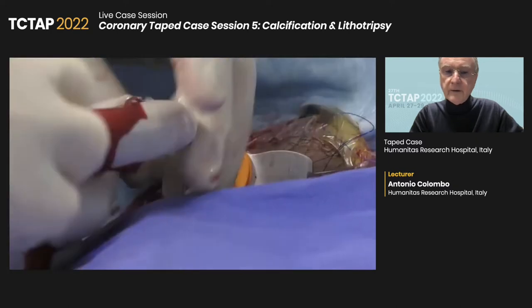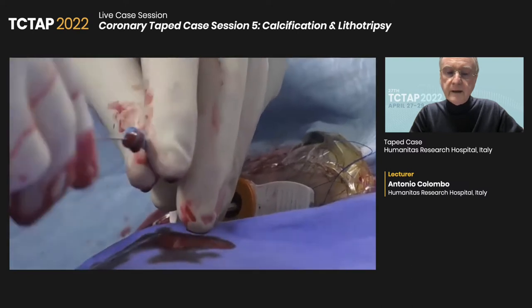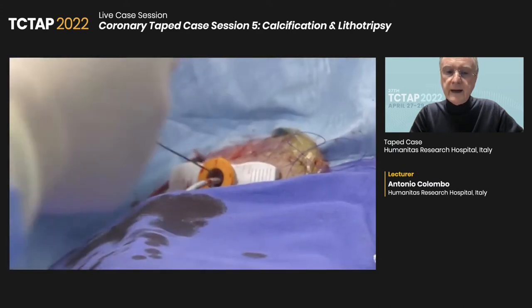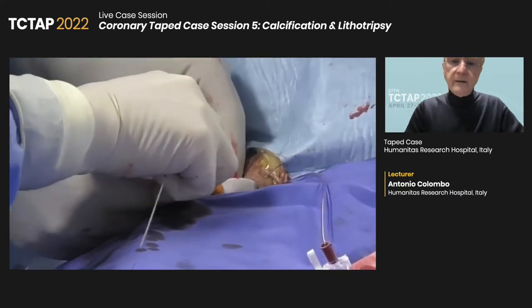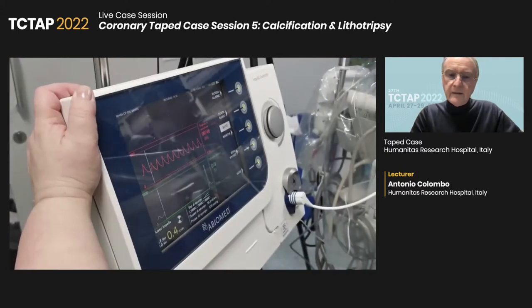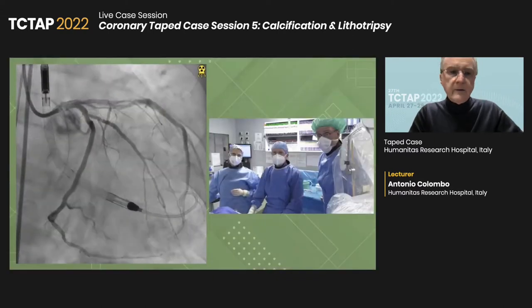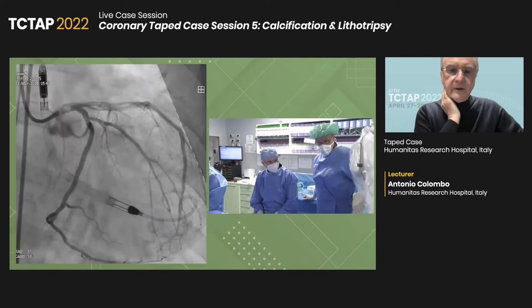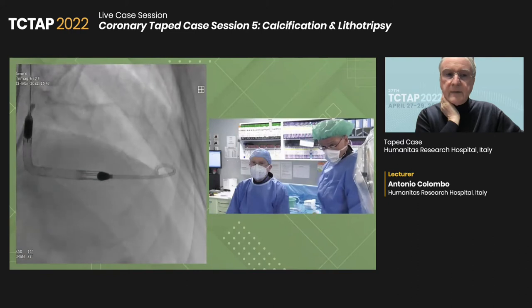So you see the puncture of the membrane of the valve. With the Impella, you can utilize the introducer to deploy the guiding catheter. You can use a 7 French or a 6 French. In this case, we take advantage to use a 7 French. And so now we have a single access, one for the Impella and one for the guiding catheter, 7 French guiding catheter. You see the Impella position in the left ventricle. And now Dr. Reimers joined me in the procedure.